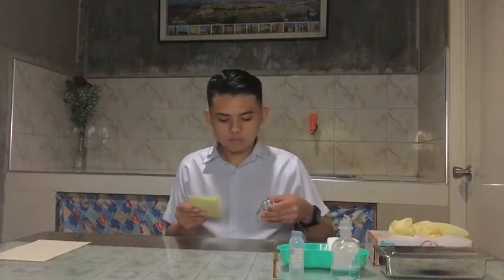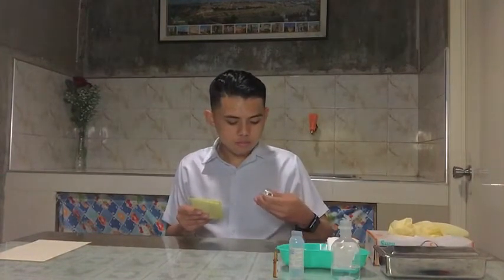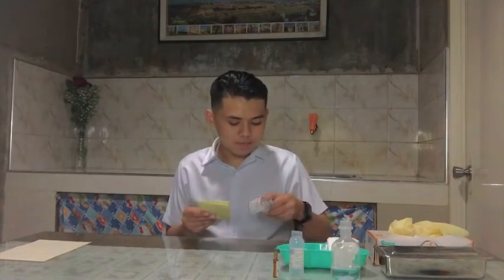Next, we will be checking the label on the medication carefully against the MAR to make sure that the correct medication is being prepared. We also have to check the expiration date here, so it's okay. This is important for us to prevent errors in medication administration.